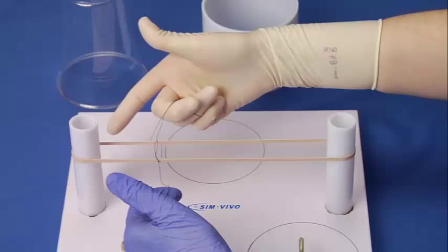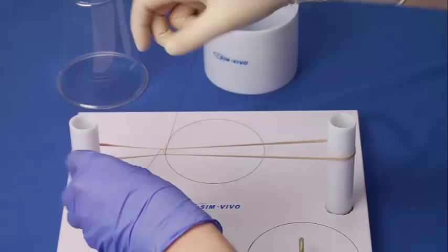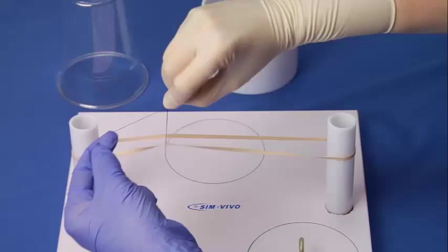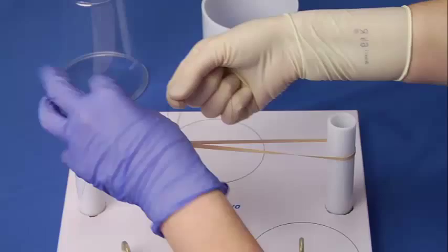If you are tying square knots, the best way to approach this is to start with a surgeon's knot. A surgeon's knot is one in which the free end is brought through the loop twice on the first throw. Do a standard throw by bringing the free end through the loop, but before you cinch down the throw, pass the suture through the loop again. Now you have a double throw that will better hold the strain because of more contact area between the strands. The rest of the throws to complete the knot are done normally.